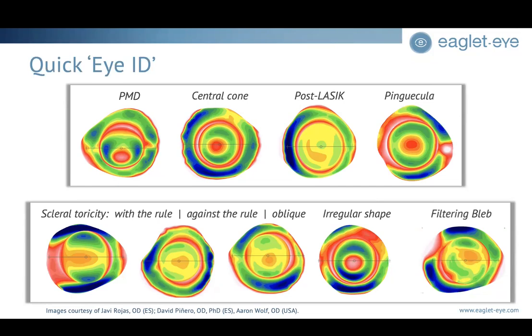But the cool thing that we've learned from images like this and from study banks with many, many patients that we've scanned using profilometry devices to get data on what ocular shape really looks like on average for most people, is that sometimes the data just doesn't come across from cornea to sclera.